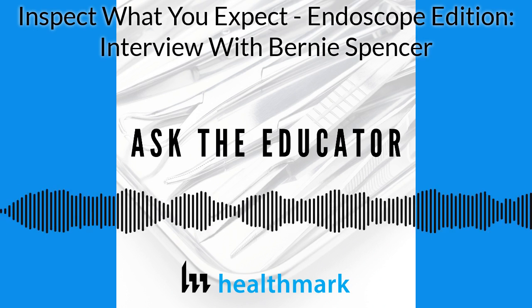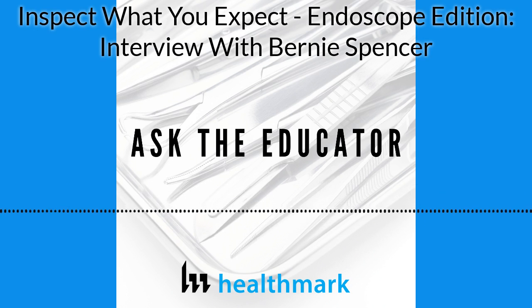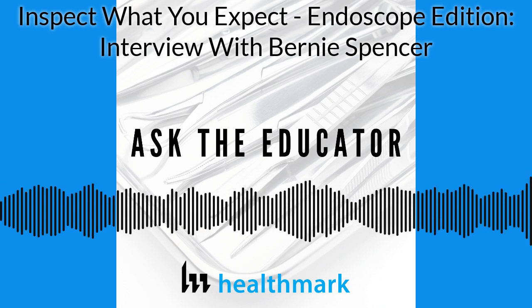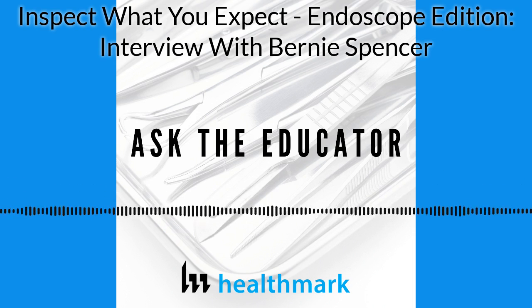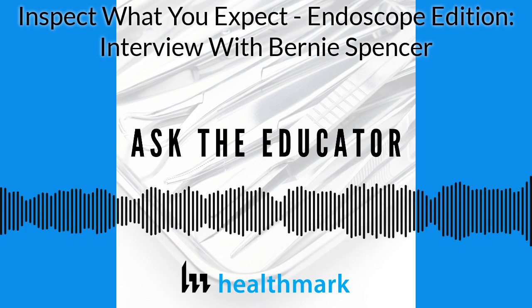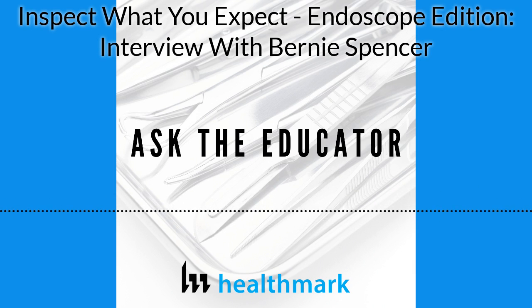At one point, and I think this is interesting, at one point during the swab test study, our scopes had anywhere from a 3% to a 10% failure rate on the test, except for one colonoscope. It had a 33% failure rate. We do periodic inspections with a borescope, and after seeing the results of that scope with the high failure rate, I looked inside the channel with that borescope and saw some damage. There was a gouge. So we sent the scope out and had that channel replaced.